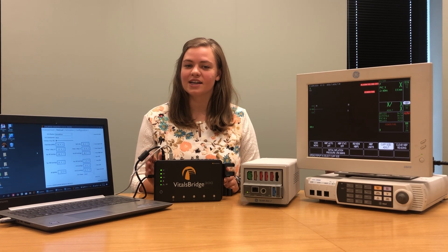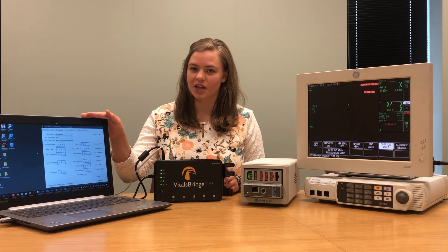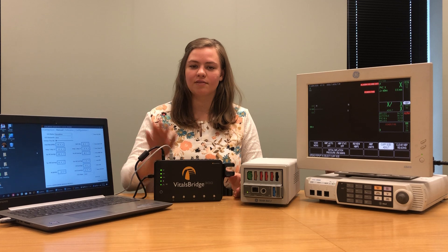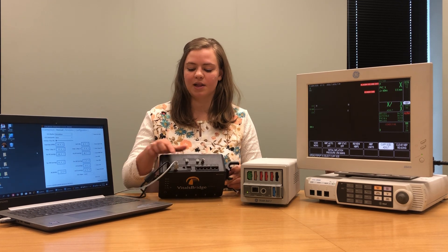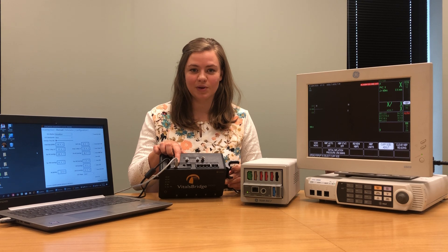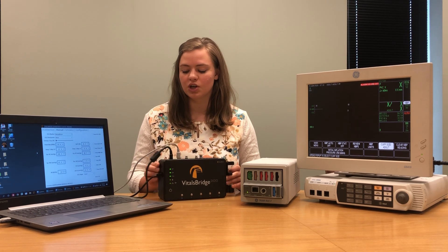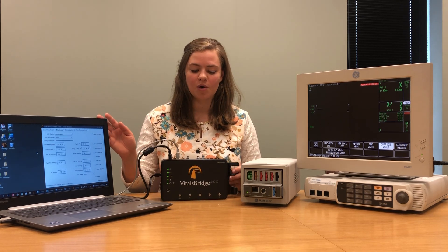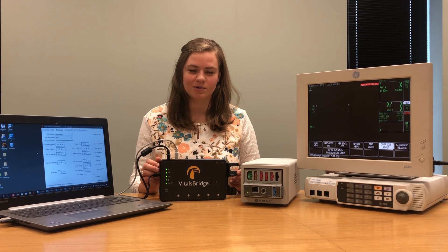Before beginning this video I downloaded the VitalsBridge connector software from VitalsBridge.com/downloads and installed it on my computer. I also connected my VitalsBridge to my computer using a USB cable. You can also use an Ethernet cable to connect your VitalsBridge, plugged in here and to the Ethernet port on your computer, or you can use Bluetooth which is configured the same way any Bluetooth device is configured with your laptop.